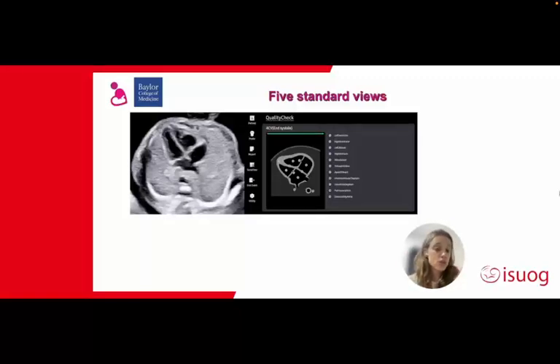The software has a series of landmarks that the image will need to meet. You can see left ventricle, right ventricle, left atrium, right atrium, the mitral valve, the tricuspid valve, the apex, the interventricular septum, the interatrial septum, the pulmonary veins, and the descending aorta. If all those are clearly visible in the image, that will give us a green light.